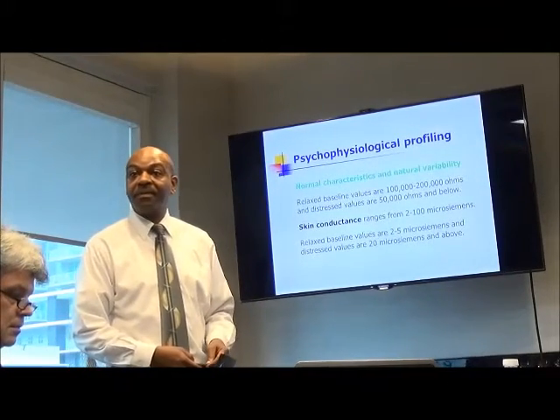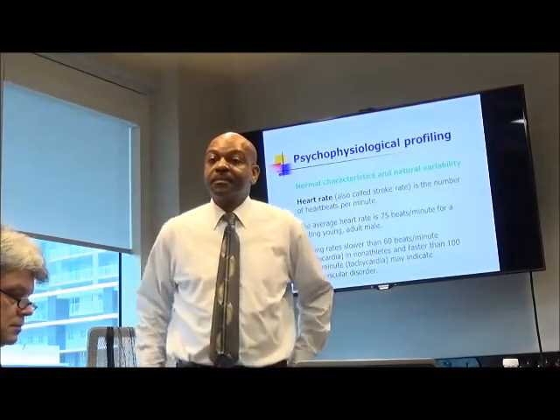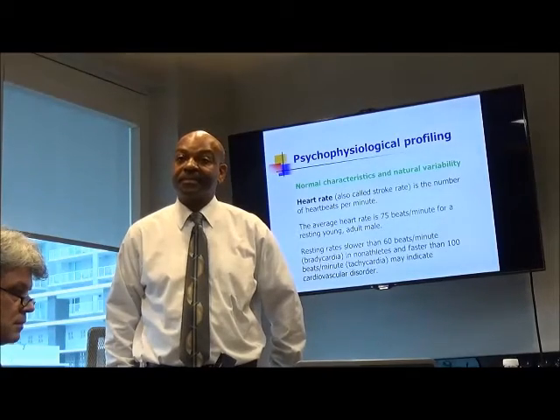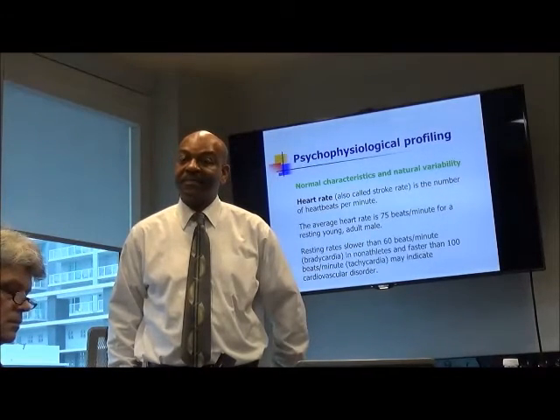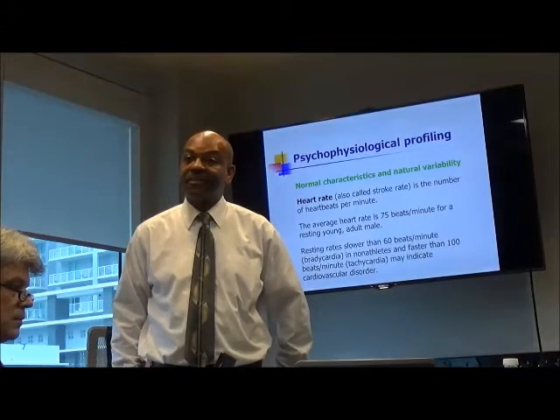Well, here I have an example from last week of a patient doing relaxation with skin conductance. He's at 1.20 microsiemens. During the stress assessment, he had 50 microsiemens.